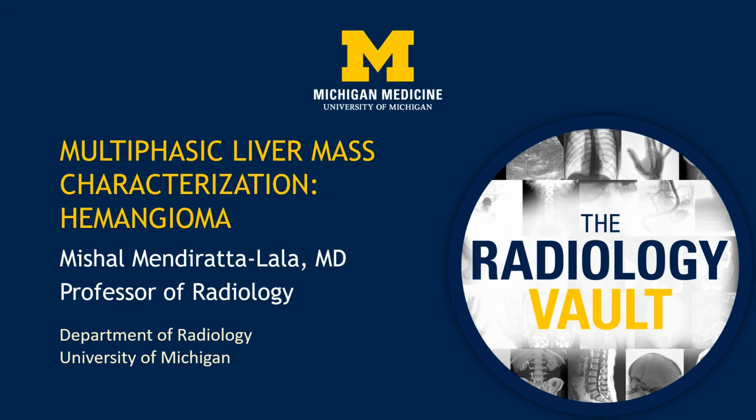Hello, my name is Mishal Mendiratta-Lala, and today I'm going to talk to you about multiphasic liver mass characterization, and we're going to focus on hemangiomas.